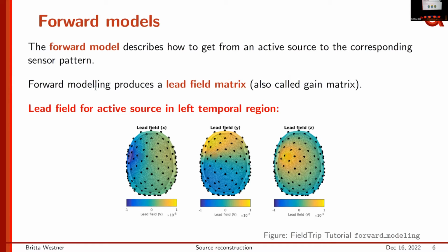And you can see that we do that 3 times because we have 3 orientations in the room, right? An x-axis, a y-axis, and a z-axis. And now we orient the source in all 3 directions, because if we have a source in the brain, a dipole, it might not only be active or not, it also has an orientation in which it is oriented and produces a magnetic field or electric currents off.